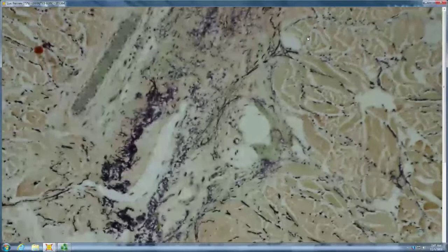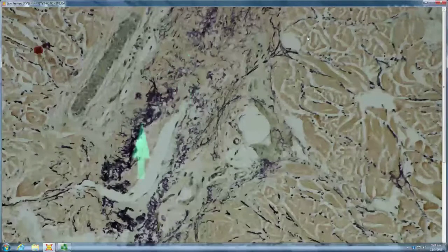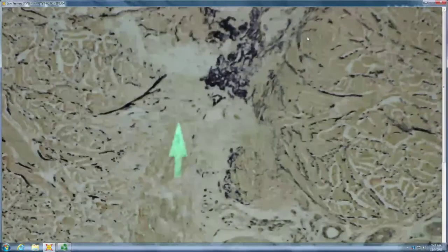Okay, now let's look at this one. So the deep part of the fibrous tract remnant. Whose turn are we on? It's my turn. Okay. Very good of you to admit that. So you've got a heavy elastic sheath on the outside, right? That's all normal. Where'd it go? Wedge shape.